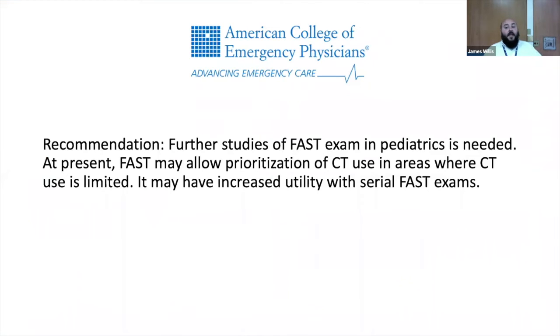So ACEP breaks it down in a policy statement. They reviewed all the information which I discussed plus a lot more, and they found that only 15% of pediatric trauma centers in the US currently have adopted the FAST exam as part of their trauma algorithms in children, mostly because of the rare occurrence of unstable children with intra-abdominal injuries.